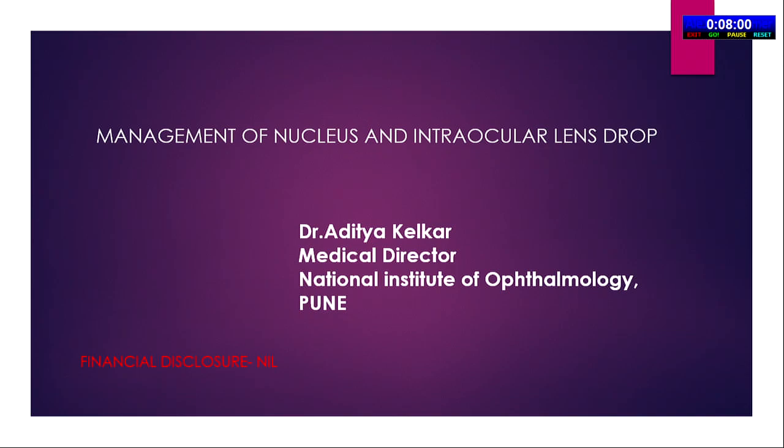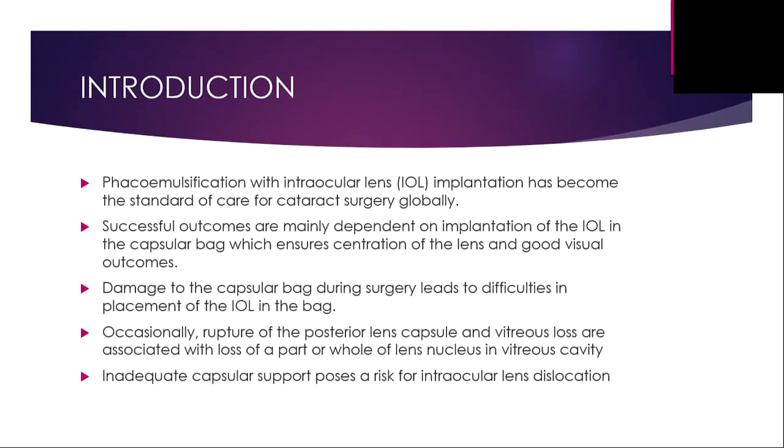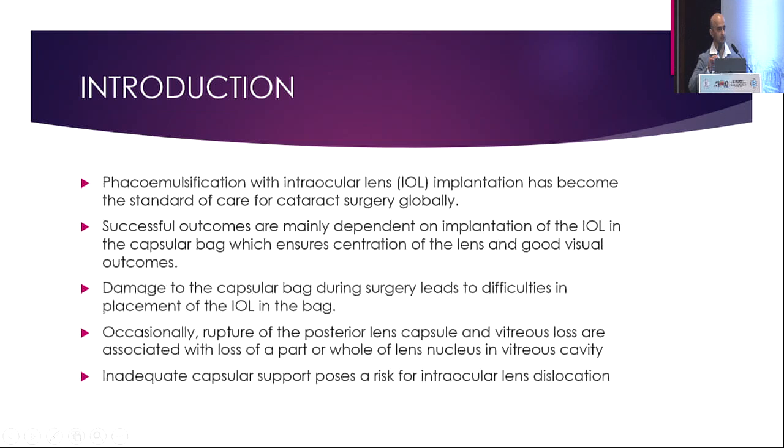Welcome to you all, and we begin our course about management of the posterior segment complications of cataract surgery. So I'm going to start the course with management of one of the most, I would say, dramatic complications of cataract surgery, like the dropped nucleus and the dropped intraocular lens.